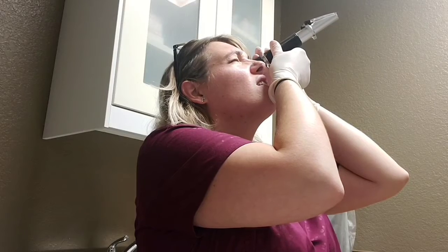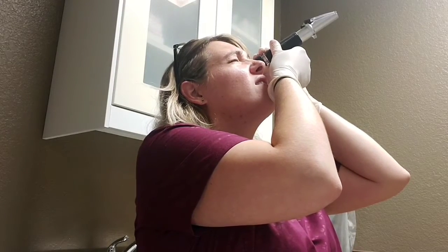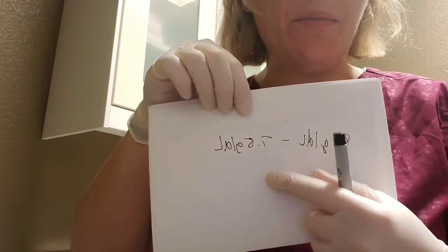It is looking like we are at 7.5 grams per deciliter. So our next step from there, as you can see, I have 8.9 grams per deciliter minus 7.5 grams per deciliter. We will do that math real quick, and I will use the calculator just to make sure my math is correct. That is 1.4 grams per deciliter, but we do want to give our results in milligrams per deciliter. So we're going to take that 1.4 and multiply it by 1,000, which gives us 1,400 milligrams per deciliter.